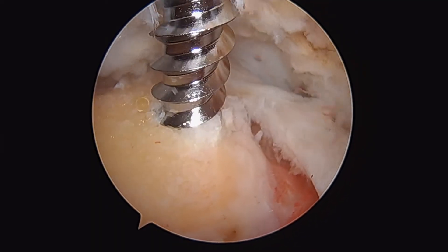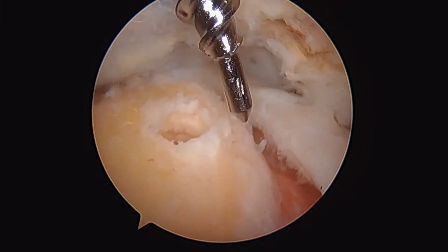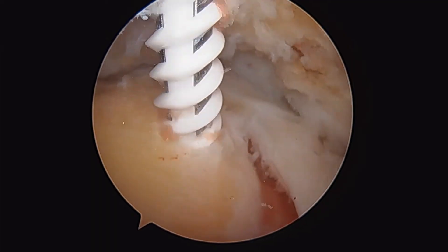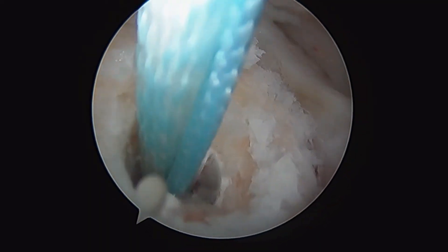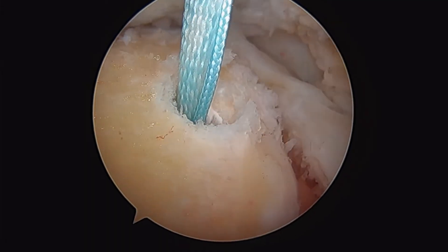Next up here is tapping for our anchors. This is a tap that we put down, and it creates a threaded hole in the humerus. Once we've done that, there's our anchor going in. And these are hollow architecture anchors. You can see there's no central portion of this anchor, which allows bone marrow to leak up into our repair tissue.